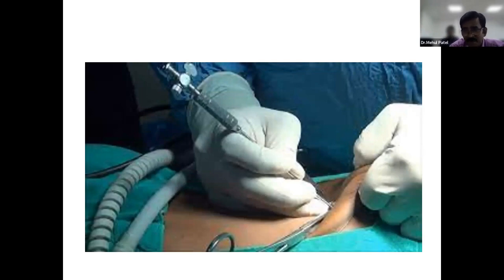And then while insufflating, keep in mind that the initial insufflation should be slow. You should keep this insufflator machine set to 1 to 2 liters of flow per minute at the beginning, because if you insufflate rapidly at the beginning, there might be a compartment syndrome. There might be compression of the IVC, and the patient may have cardiac changes, or even sometimes cardiac arrest. So keep in mind that the initial setting of the insufflator should be 1 to 2 or at maximum 3 liters.